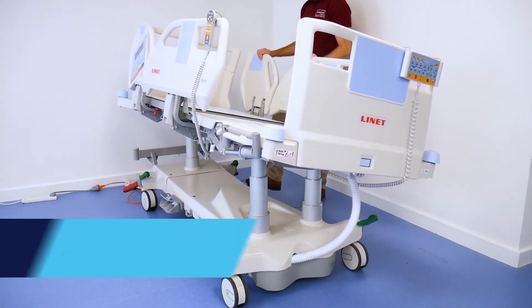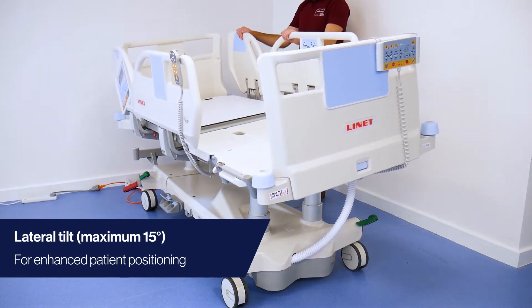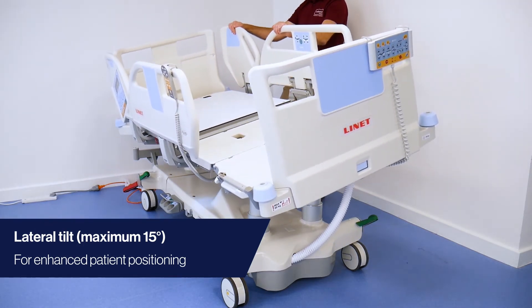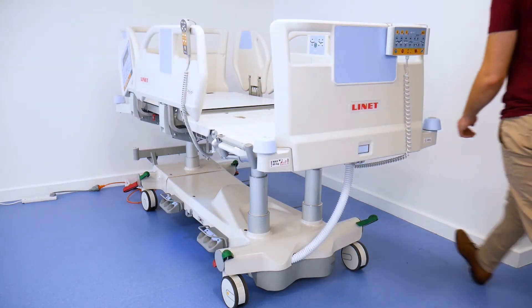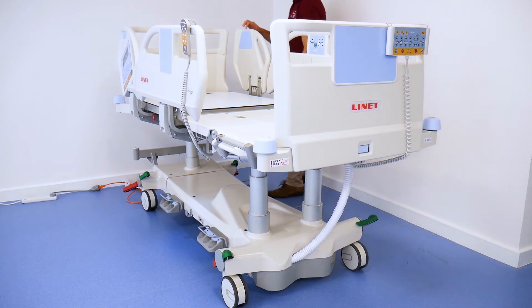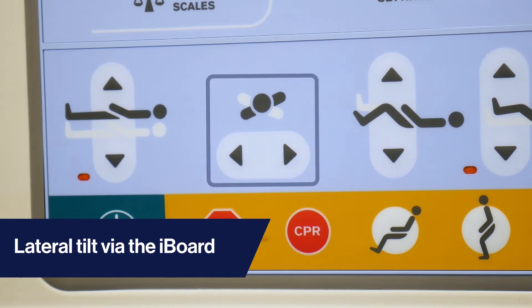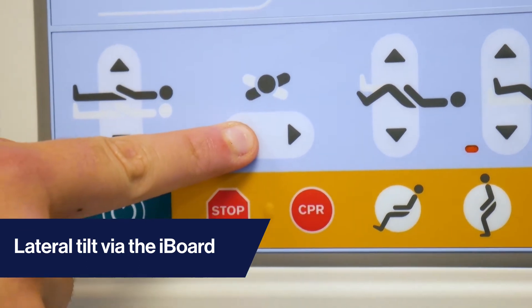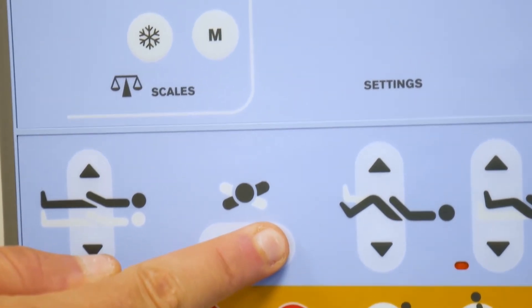The Eleganza 5 offers innovative lateral tilt solutions for enhanced patient positioning whilst reducing manual handling efforts. If you need to operate the lateral tilt, there are two main options available. From the iBoard panel, utilise these buttons. The left button tilts the bed to the left, and the right button tilts the bed to the right.